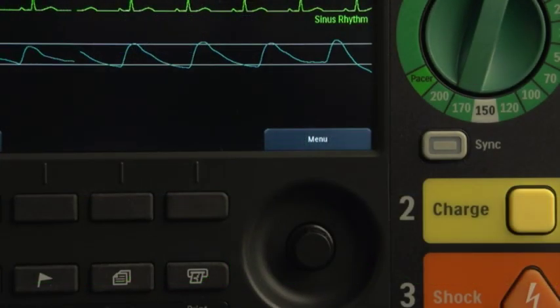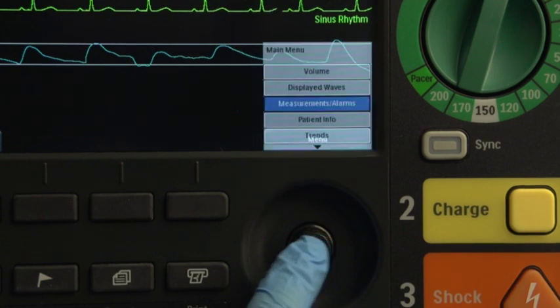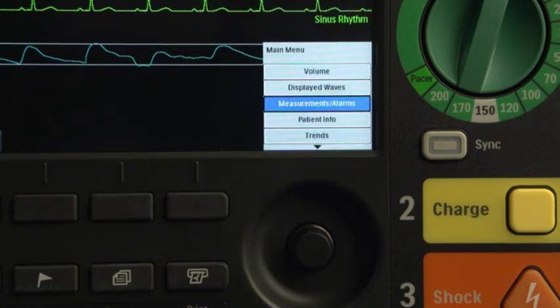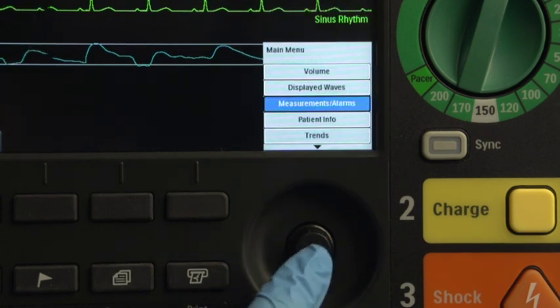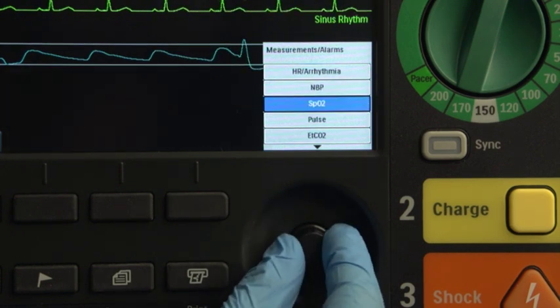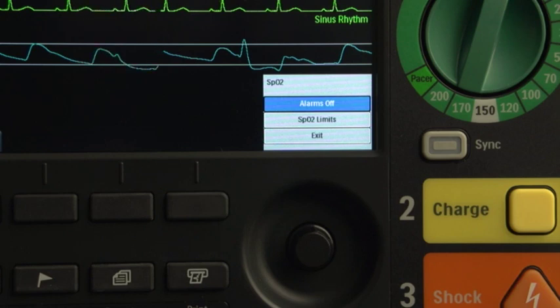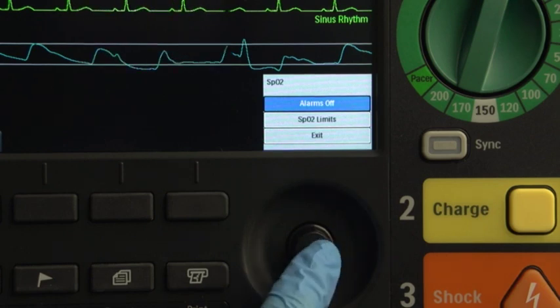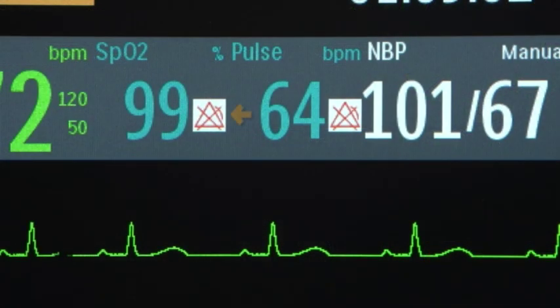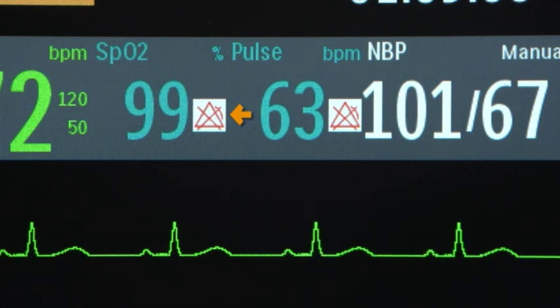If you need to turn off an alarm, press the Smart Select knob. Navigate to measurements alarms, SPO2, and alarms off. The menu closes and an icon appears next to the SPO2 measurement indicating that the SPO2 alarm is off.